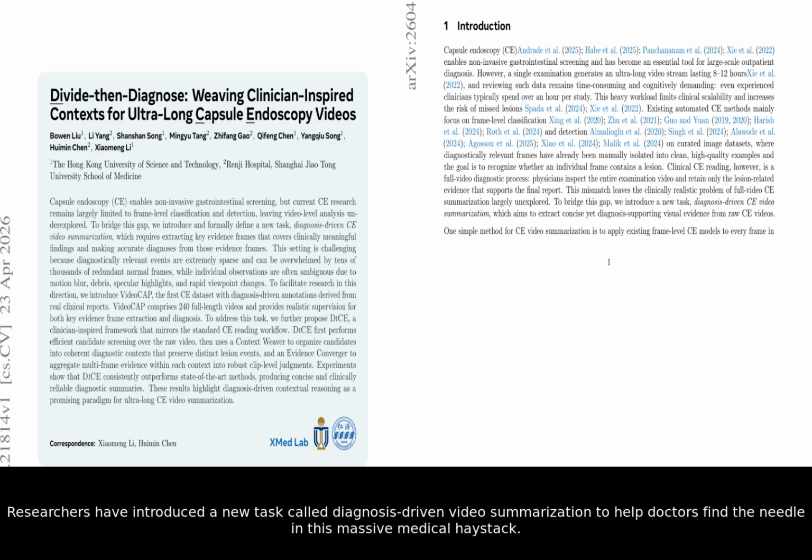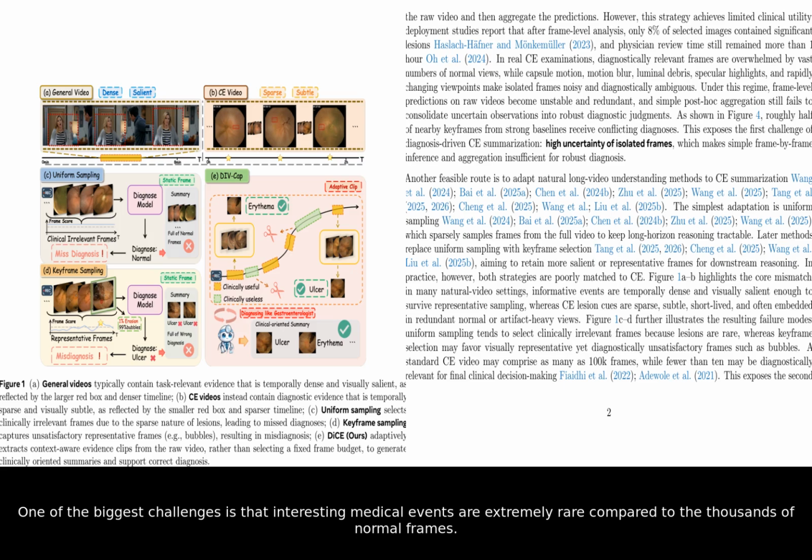massive medical haystack. One of the biggest challenges is that interesting medical events are extremely rare compared to the thousands of normal frames. Simple methods like taking a snapshot every few minutes often miss the lesions entirely or capture useless frames of bubbles and debris.